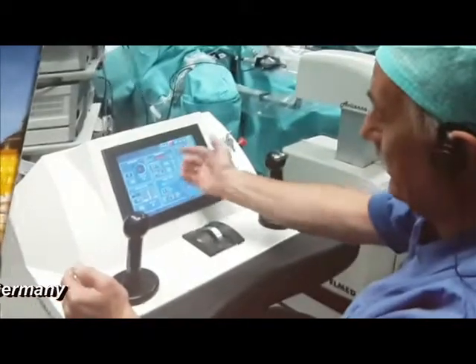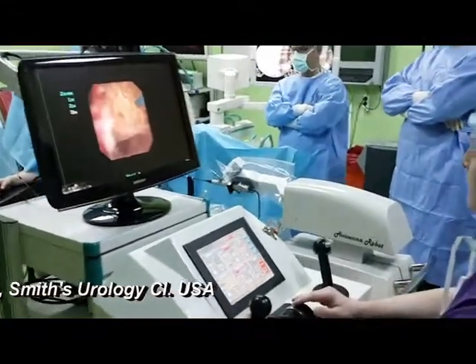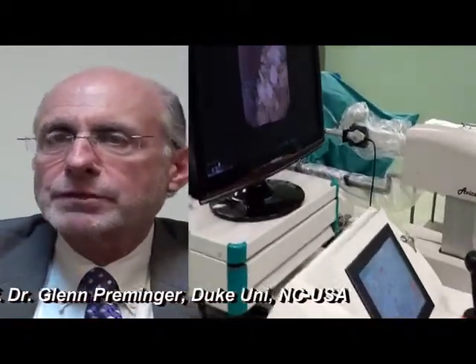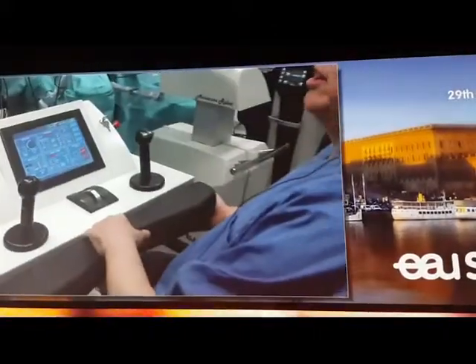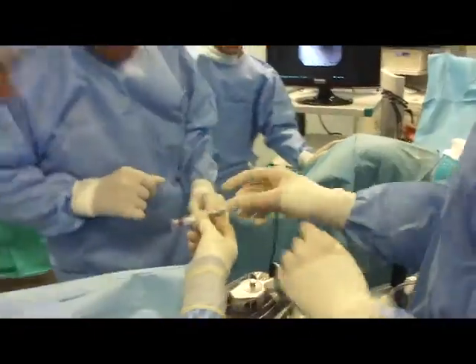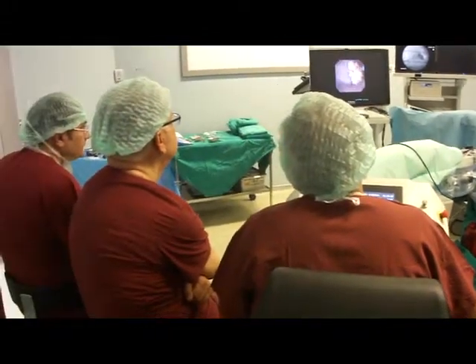With its increasing applications, flexible ureteroscopy may represent a challenging technique, particularly in complicated cases. The Avicina Roboflex provides a suitable and safe platform for robotic flexible ureteroscopy with significant improvement in ergonomics. Future studies will evaluate the impact of this robotic device on clinical outcomes. Experts in flexible ureteroscopy from Germany, France, and the United States have come to Turkey to perform robotic flexible ureteroscopy.